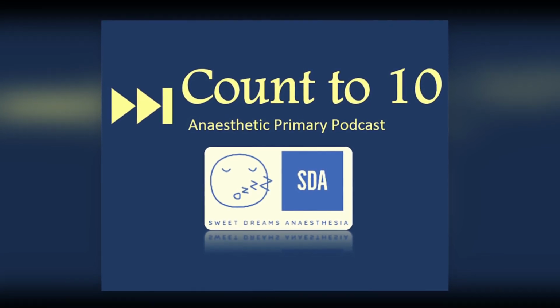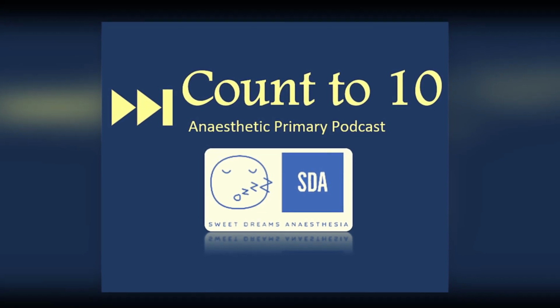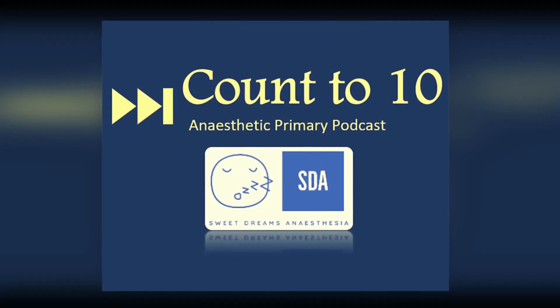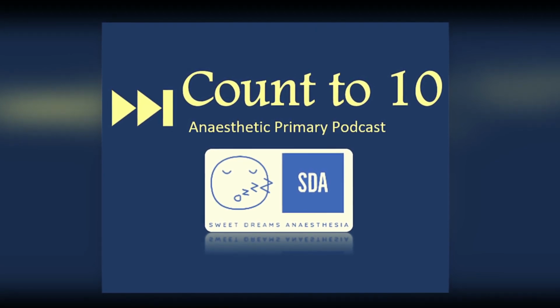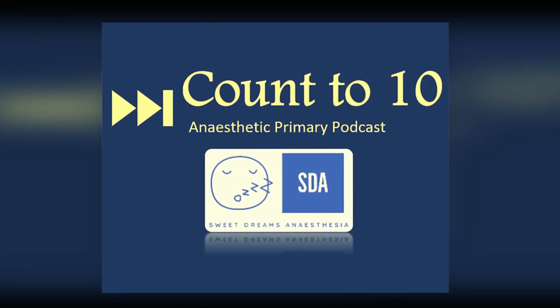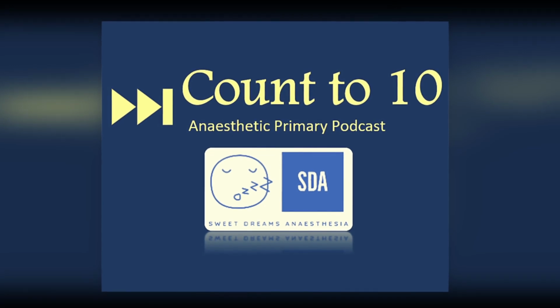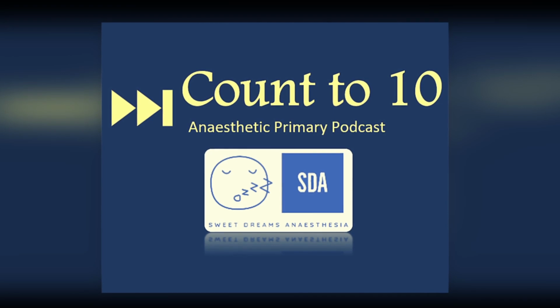In those studies where those numbers were calculated, they were measured using blood samples, so SaO2, and unfortunately you just have to know those R values off the top of your head. So an R of 0.4 is 100%, an R of 1 is 85%, and an R of 3.4 is 0%. The other thing you should incorporate into this answer is the R equation itself, and you should practice writing it down multiple times before the written date.